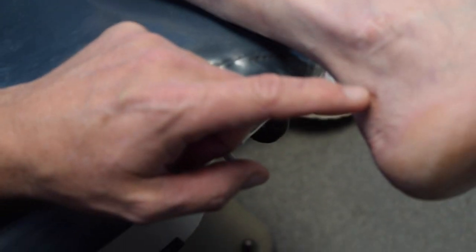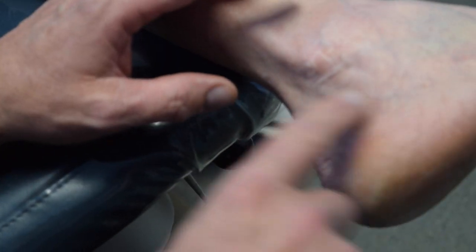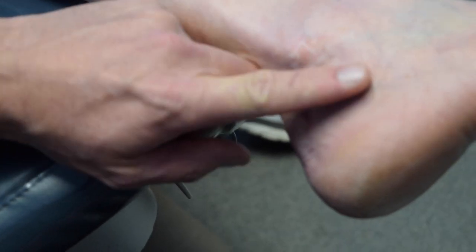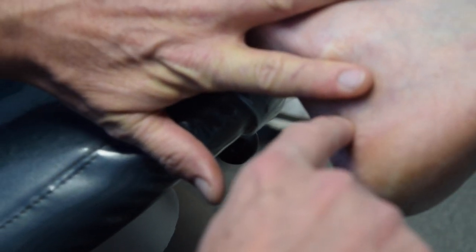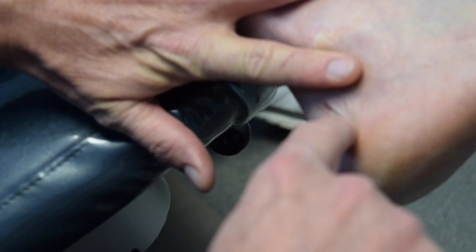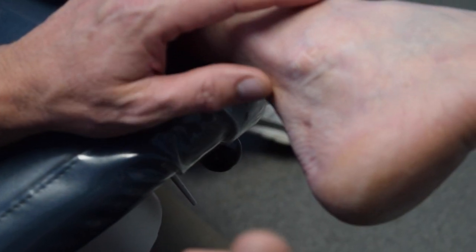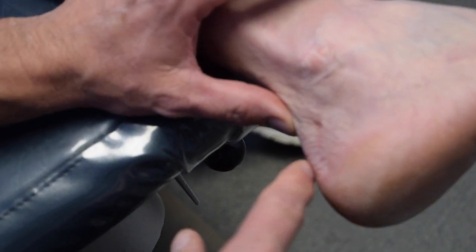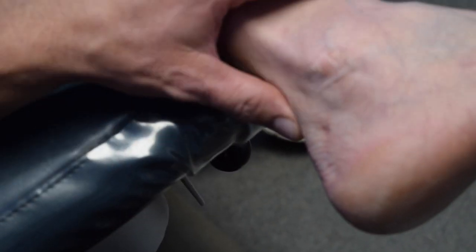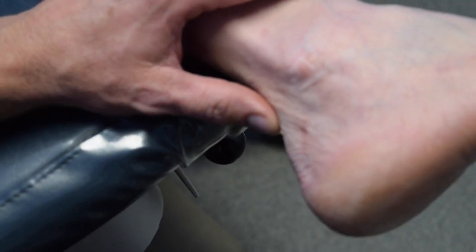You can see where we made our incision and where we took the spur. We mapped down our sural nerve to make sure we weren't going to hit that — it would be right here. When we made our osteotomy we made it in this direction and actually folded the bone forward, which shifts the Achilles tendon forward as well. It does shorten the bone to some degree, so it's not for every patient.